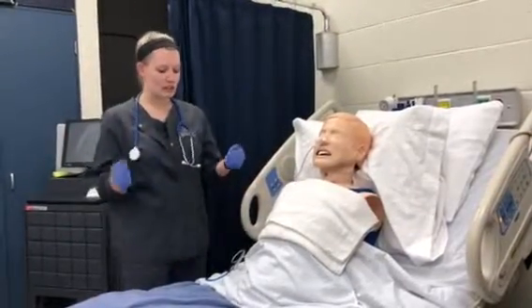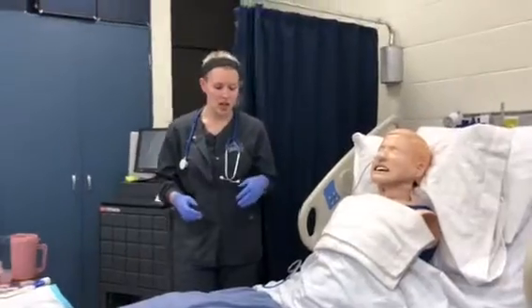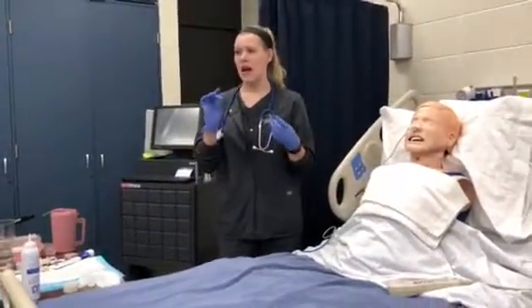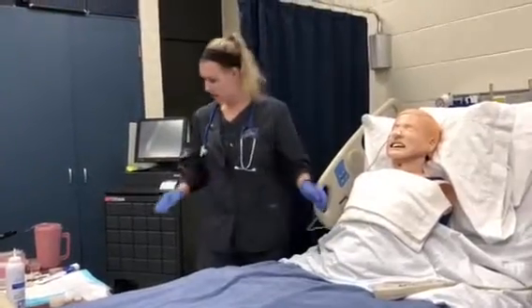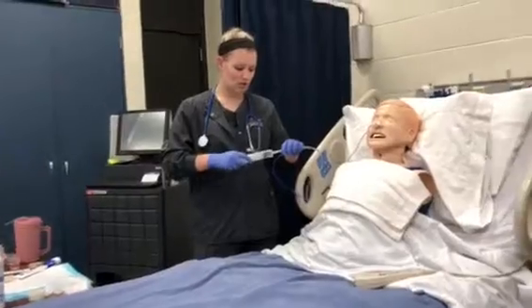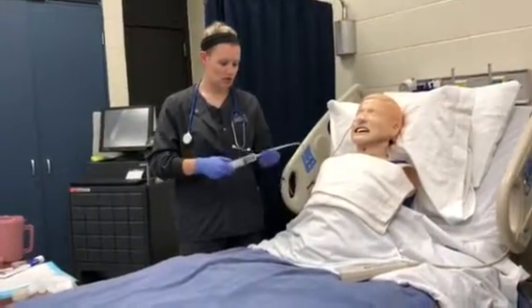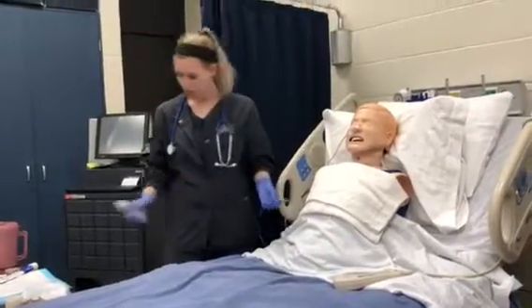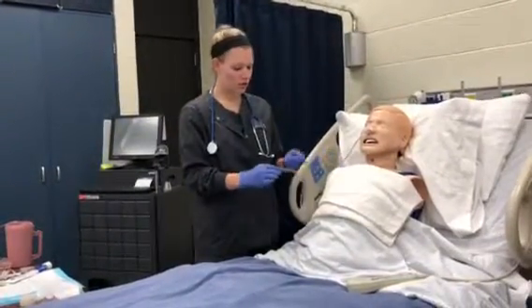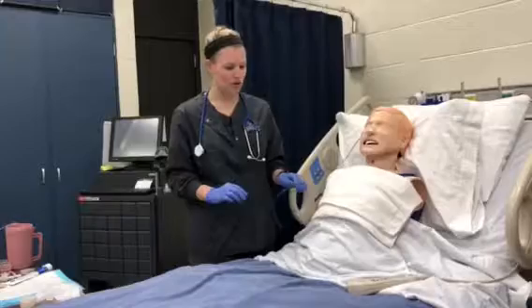So now that our tube is in and we have confirmed that it's working, we would make sure that we aspirate residual, so that we know the tube is working.